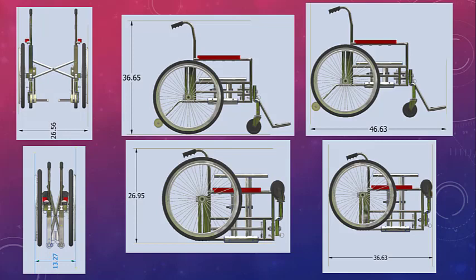My chair features a 17-inch seat and is 61 pounds in weight. Dimensionally, my chair expanded is about 26.5 inches in width, 36.65 inches in height, and 46.63 inches in depth. My chair collapsed is 13.27 inches in width, 26.95 inches in height, and 36.63 inches in depth.